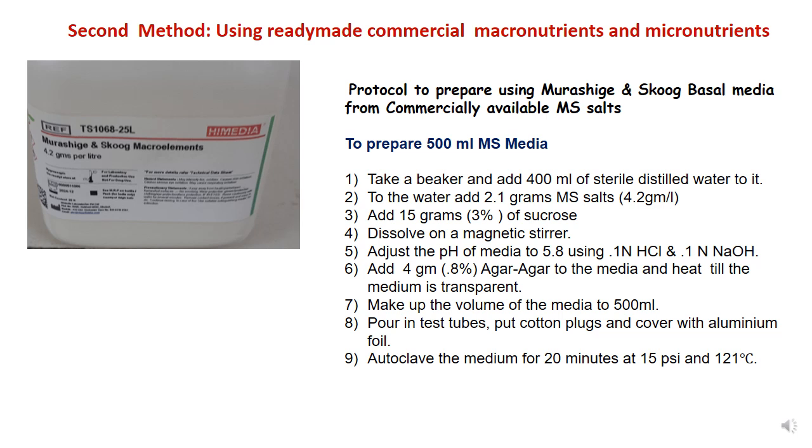Like here you can see that if we are taking this salt, this is a macronutrient, so we take this salt, we add sucrose, we add agar agar according to our requirement, and then we adjust the pH, and then we autoclave it, and the medium is ready. So this is when we do not have stock solutions, and we directly go for the media which is already available in the form of commercial salts.